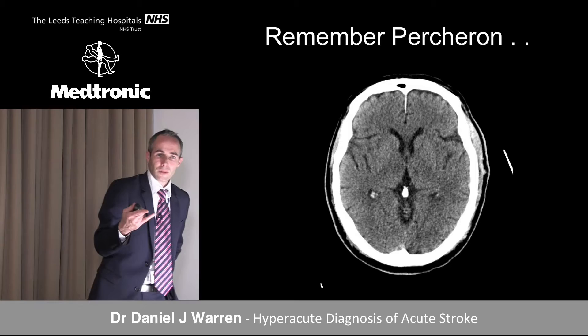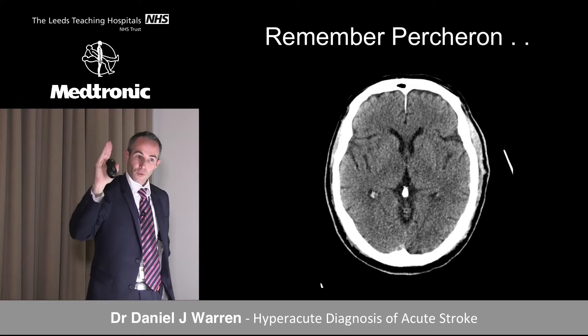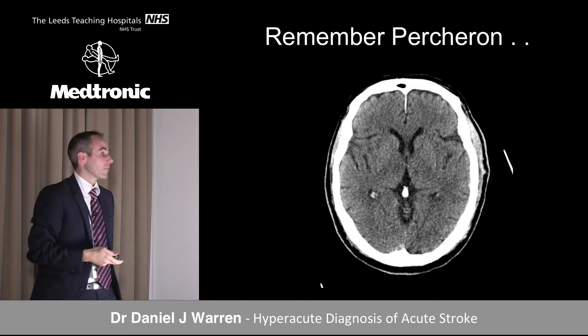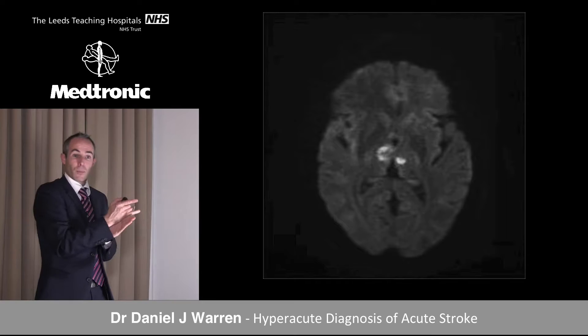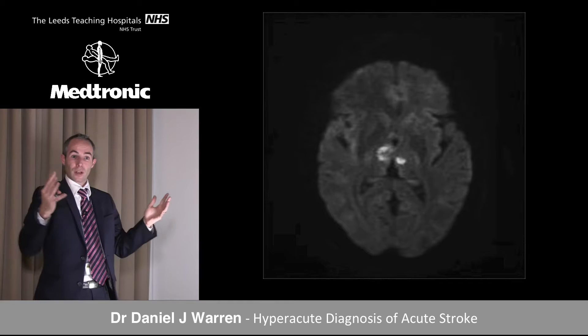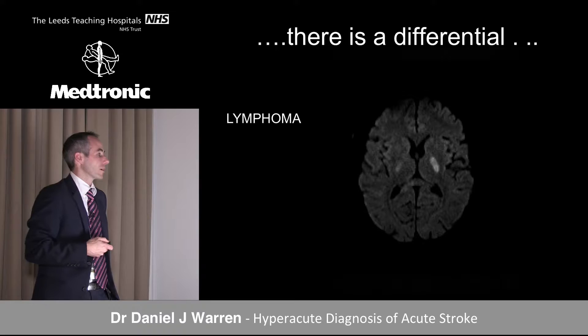If you see bilateral infarction it can still be arterial — the artery of Percheron is a common dominant perforator branch off the P1, giving perforators to both thalami. Subtle reduced attenuation on CT, confirmed on MR with diffusion restriction, gives bilateral thalamic infarction in a single arterial territory. Other considerations include venous insult, which often causes a lot of swelling. Not everything that restricts is infarction — bilateral lateral thalamic and lenticular nuclear T2 signal with diffusion restriction can represent lymphoma.